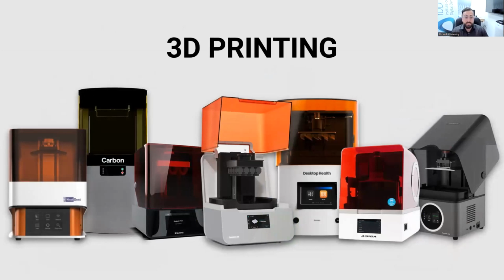Then more excitingly is printing, and printing is much more of an exciting topic than milling because, frankly, it's just much cheaper. The cost and barrier of entry is much lower than a milling machine. And so with printing, it's incredible what you can do in the practice now. I don't believe all this hype that printing will replace milling machines. I think that's ridiculous, but there's definitely this dynamic, and any modern lab or modern practice that is doing in-house production will no doubt utilize both milling and printing because they complement each other.